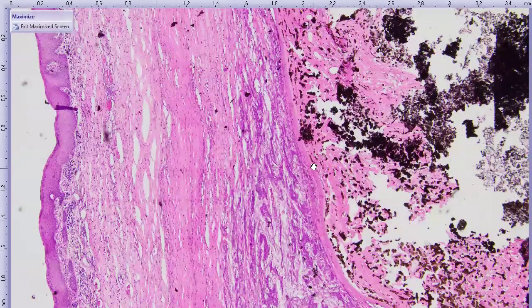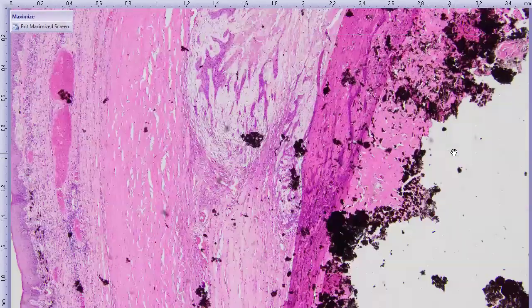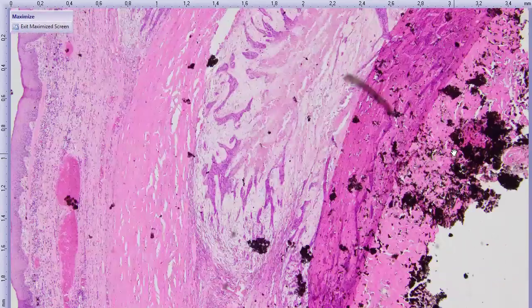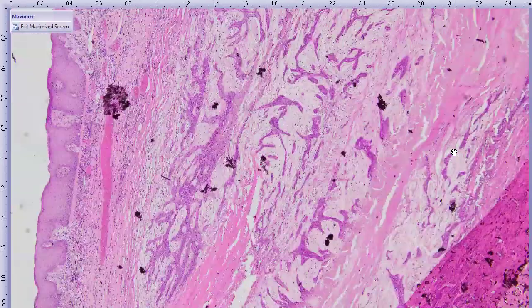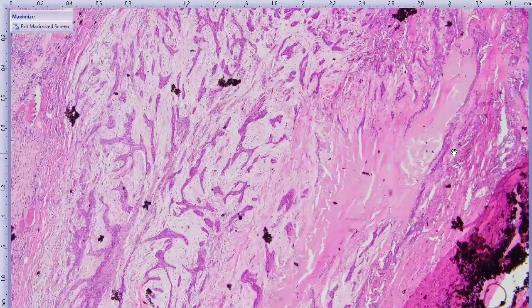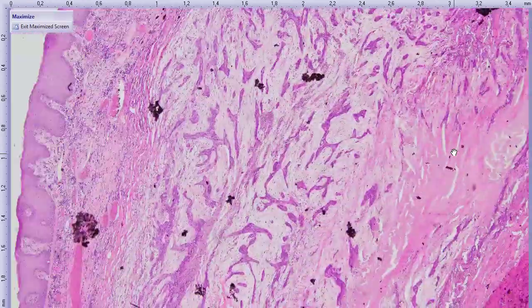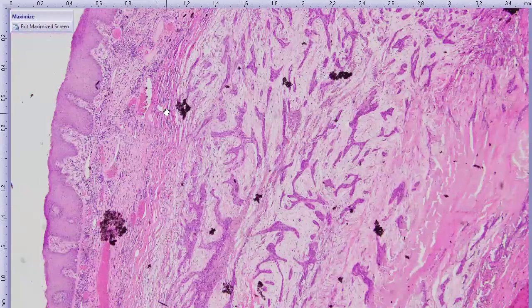So we know that anything from here on is intraocular. Maybe very obvious to say that, but it's useful to get a sense of where we are. Now, when we move around, things change a little bit.